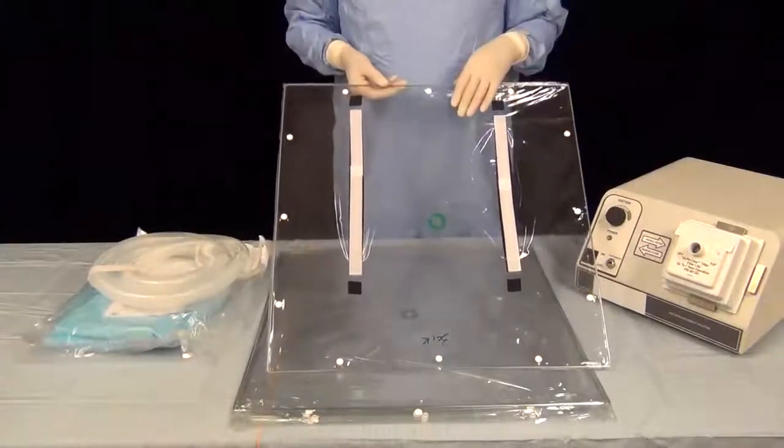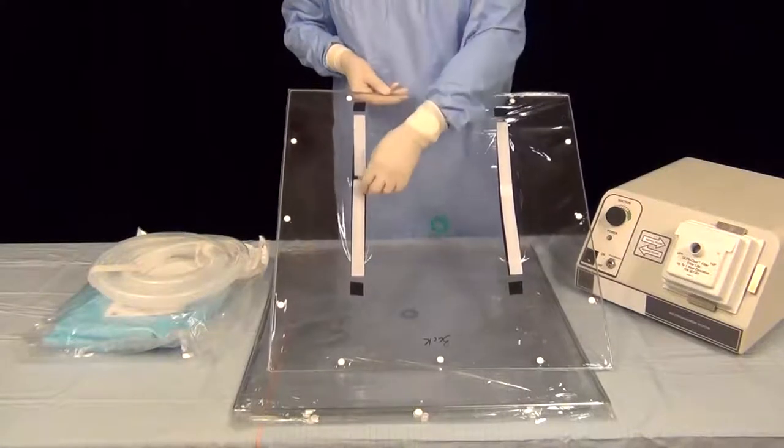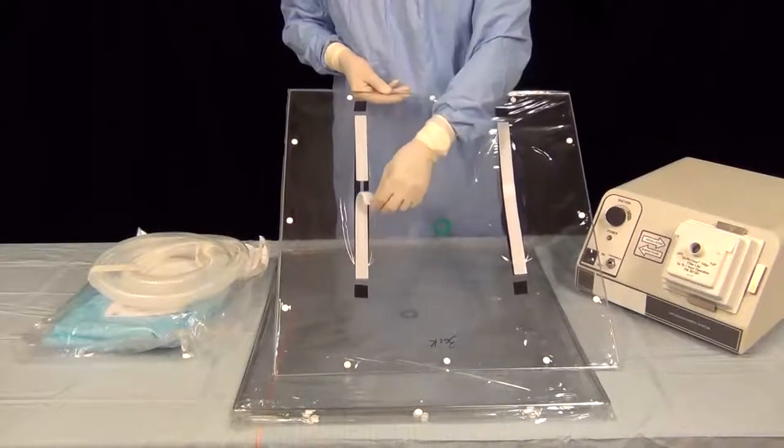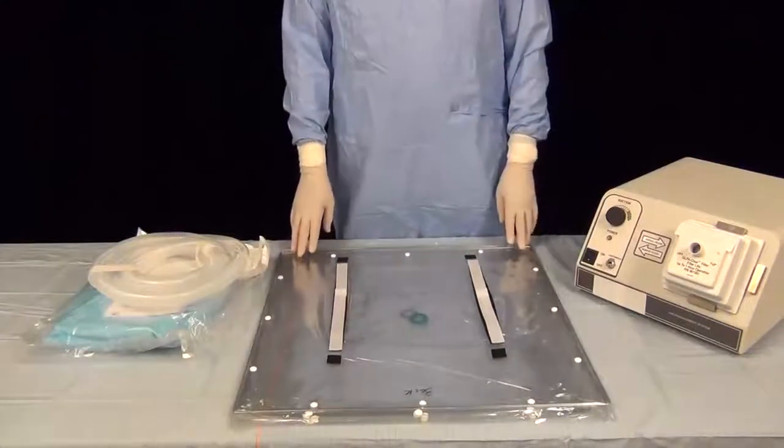And in this wall, we have placed our own resealable access ports that I'll demonstrate to you a little later. And that completes the enclosure.